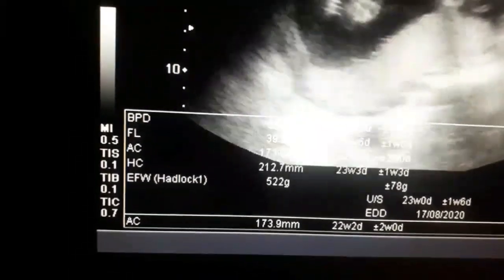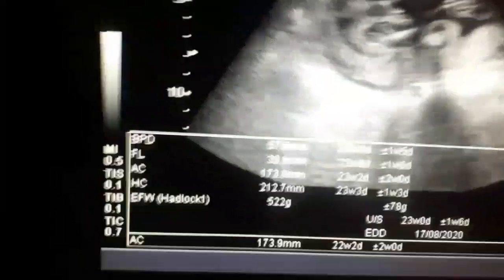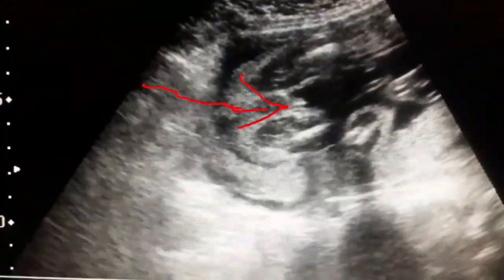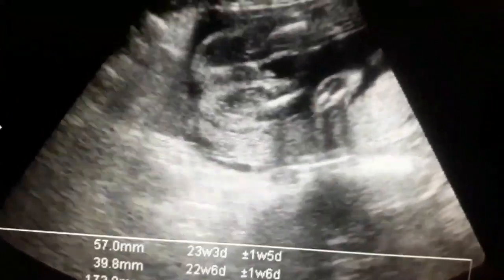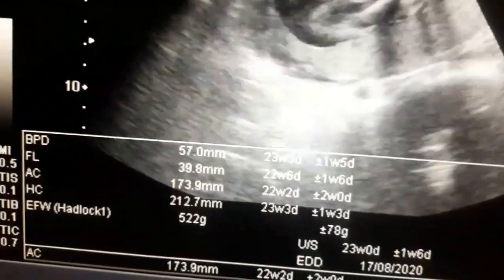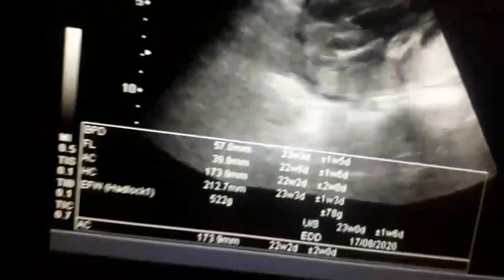These are the measurements on the table. Look at the sex of the baby — the arrow shows the penile tip, very clear, scrotal sac and the penile tip. With practice you come to know how to appreciate and demonstrate the sex of the baby. Look at the scrotum.